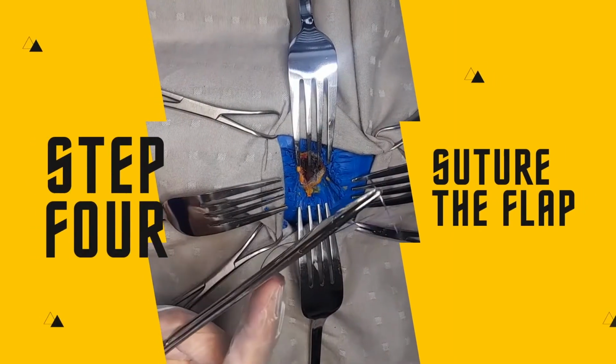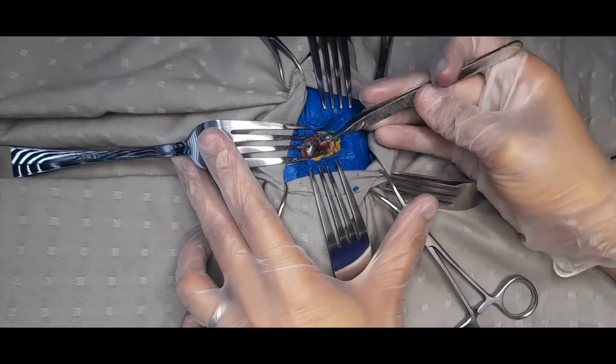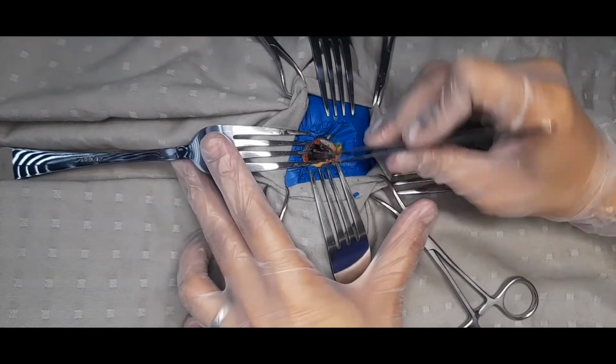Step 4. Suture the flap. Reflect the Bjork flap inferiorly and suture the flap to the skin.